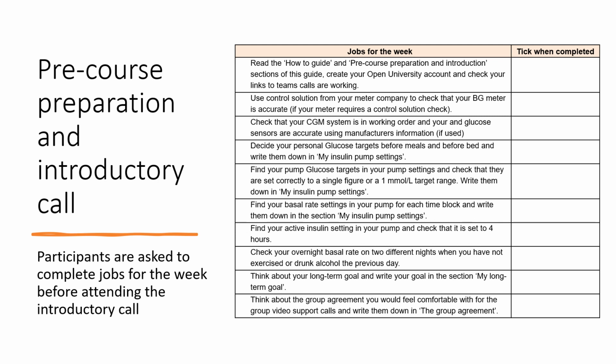The lesson plan for the introductory call is in the Educator Manual Pre-Course Preparation and Introductory Support Call section. We recommend that the introductory call is at the beginning of the week so that participants are clear about what they are expected to do and have the rest of the week to check overnight basal rates before accessing week 1 of the online course and moving on to basal rate checking in the morning and afternoon time blocks before their week 1 group video support call at the end of week 1.